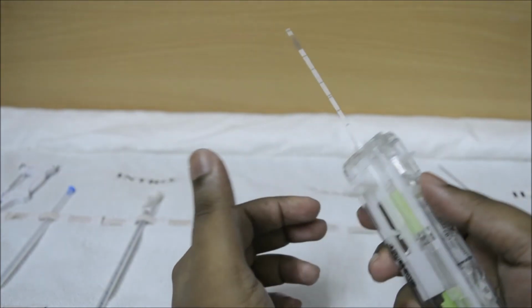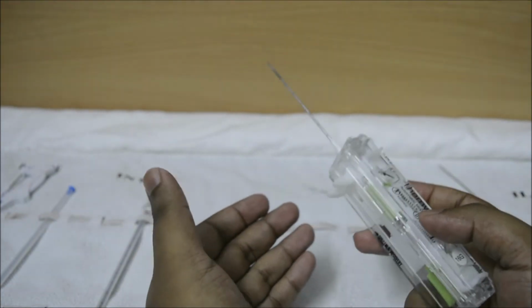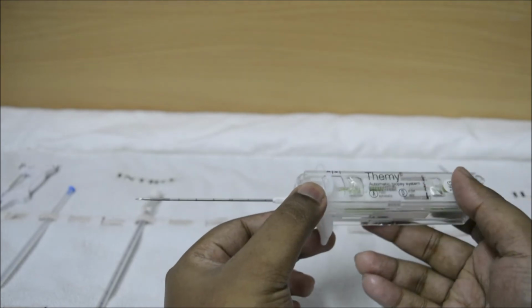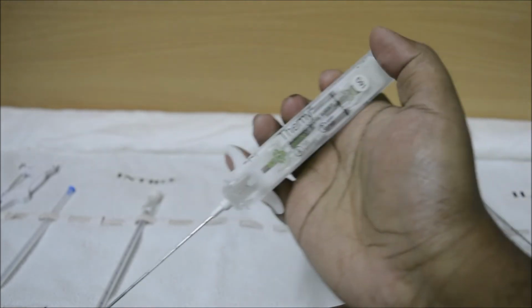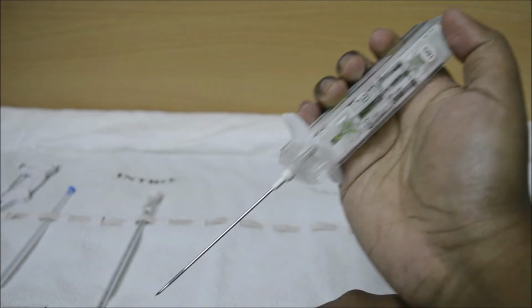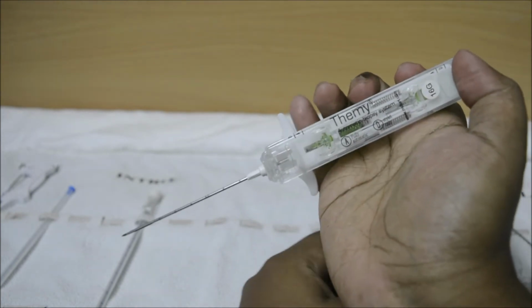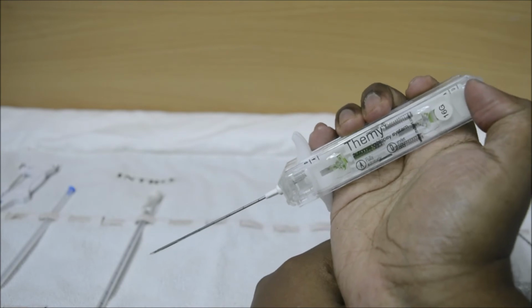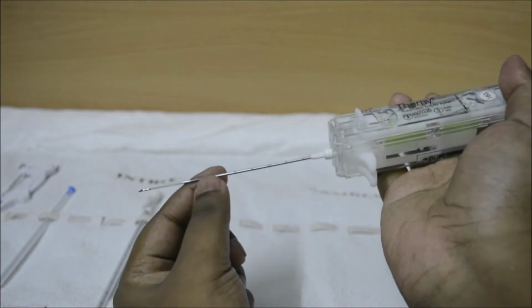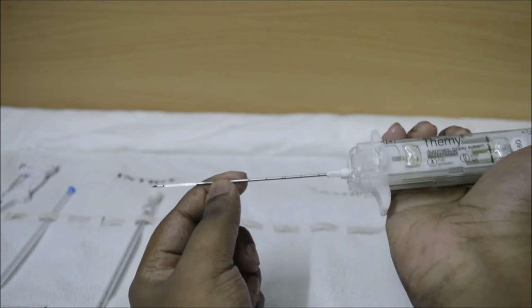Now, it depends on the choice of the doctor how he will insert the needle. For example, if it's a breast cancer tumor, the doctor prefers to hold it like this, and then under the CT guidance the needle is inserted. Now when the needle is inserted, the doctor can push it once.